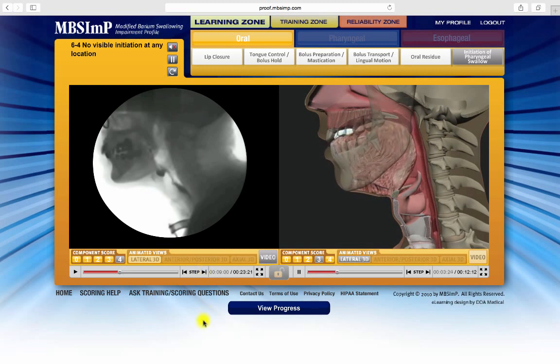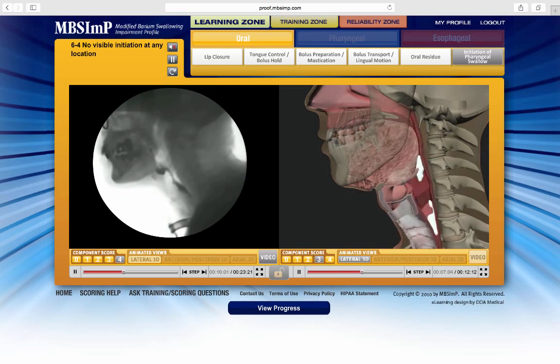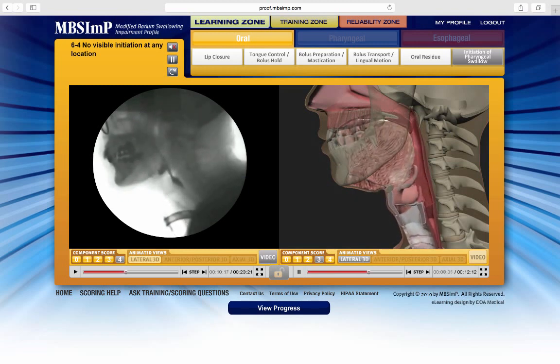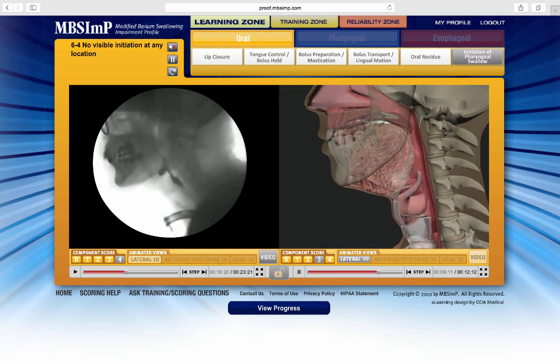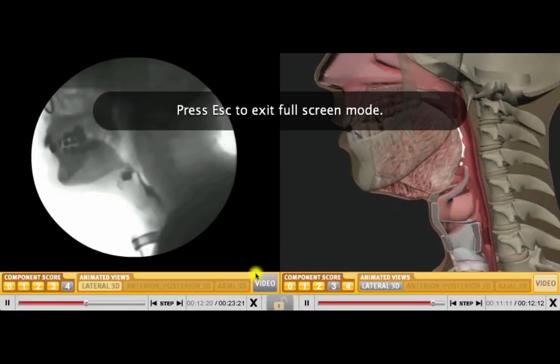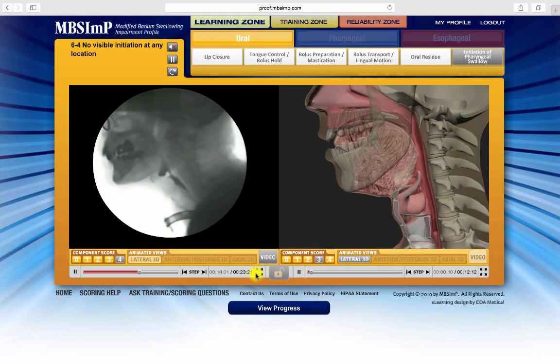Alternately, the keyboard can be used. The space bar is the pause-play toggle, and the left and right arrow keys are used for frame-by-frame viewing. Click here for full screen mode, and press the escape button to return to normal view.